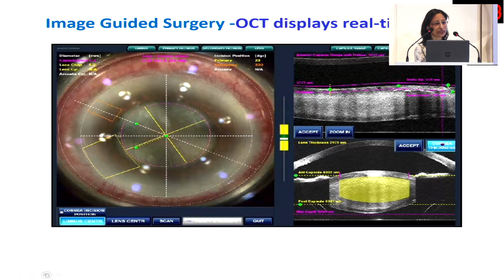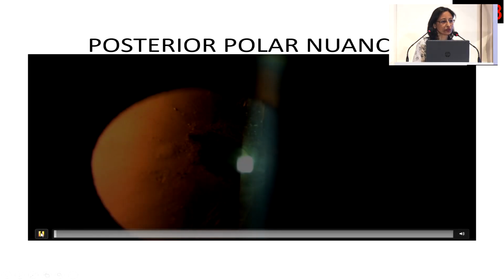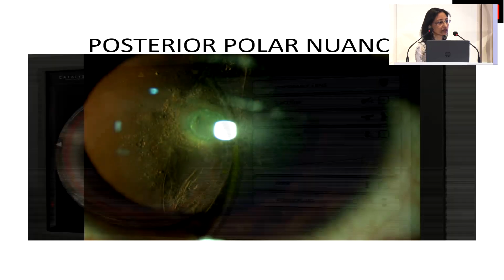Now all the femtosecond lasers also have real-time OCT integrated in them, and that feature is very useful when we deal with posterior polar cataracts. Video please. So this was a case where the patient has posterior polar cataract with pre-existing capsular rupture.